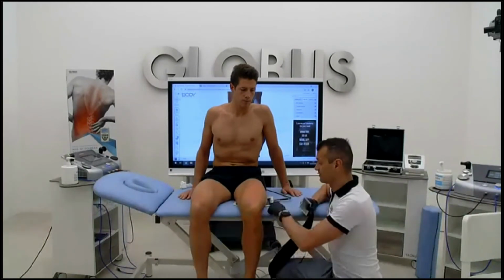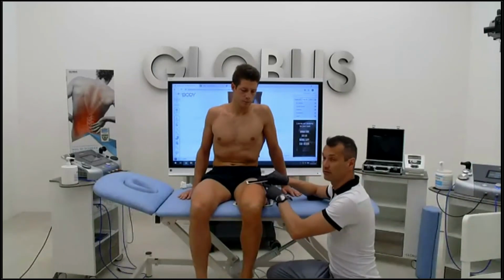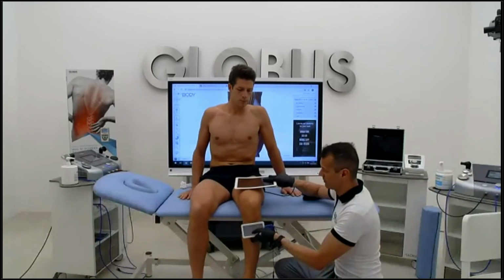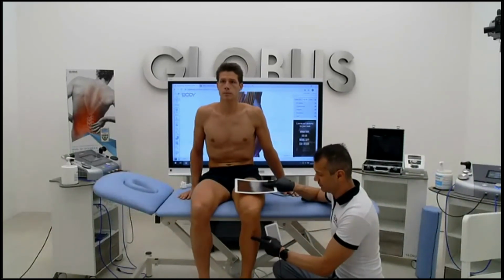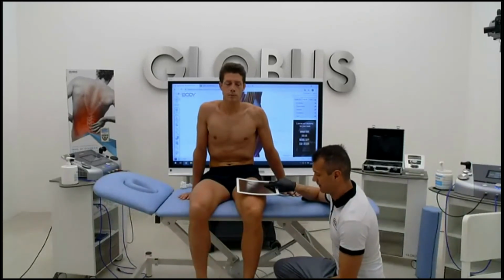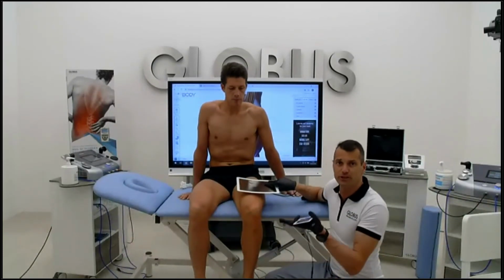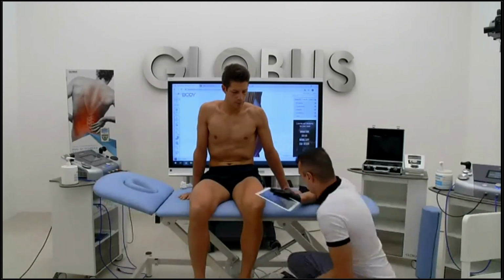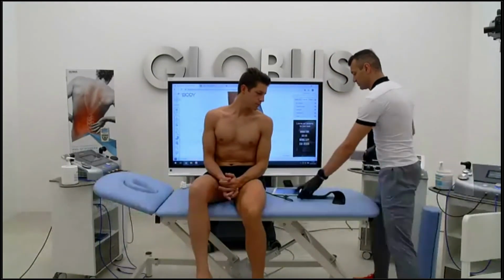So always keep in mind the geometry, the opposite geometry between up and down, or the coplanar geometry, where we have this kind of application. This is just an example, but just to make you reason that it is very important how you put the plate, and also the frequency can help you select the superficial layers or the deeper layers. Okay. Any questions or doubts around what we said before?